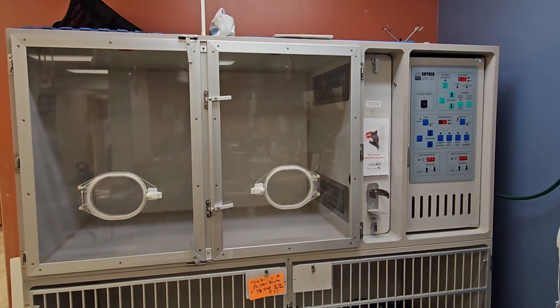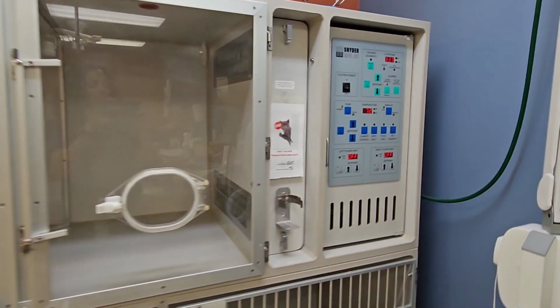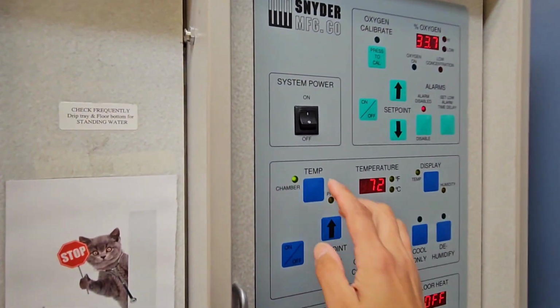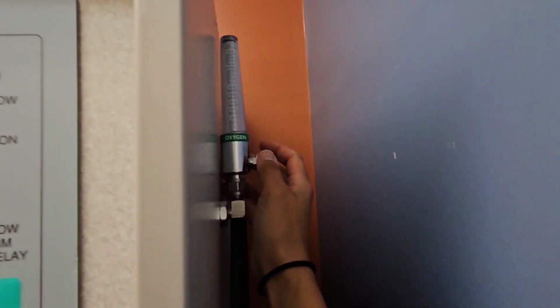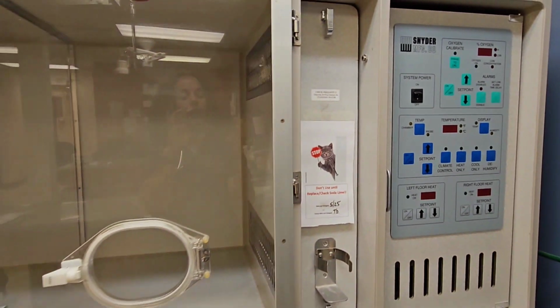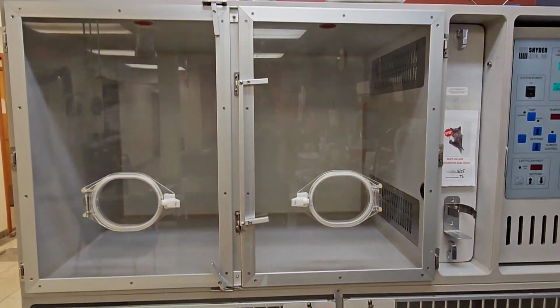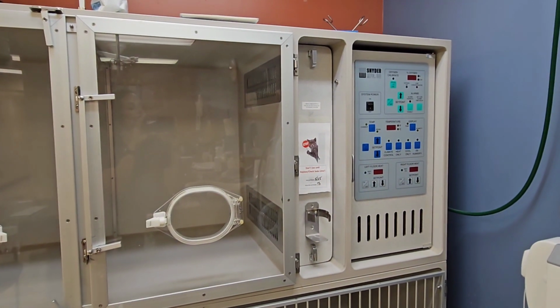Okay, pretending that our patient is all done in the oxygen cage, really we can just come on over here and turn it off. We can also turn the flow meter all the way off. The ball's already down because the machine's off, but this is off, ready to be off for the calibration for next time. Always be sure to clean your cage, but otherwise you really just need to turn it off and it's all set.